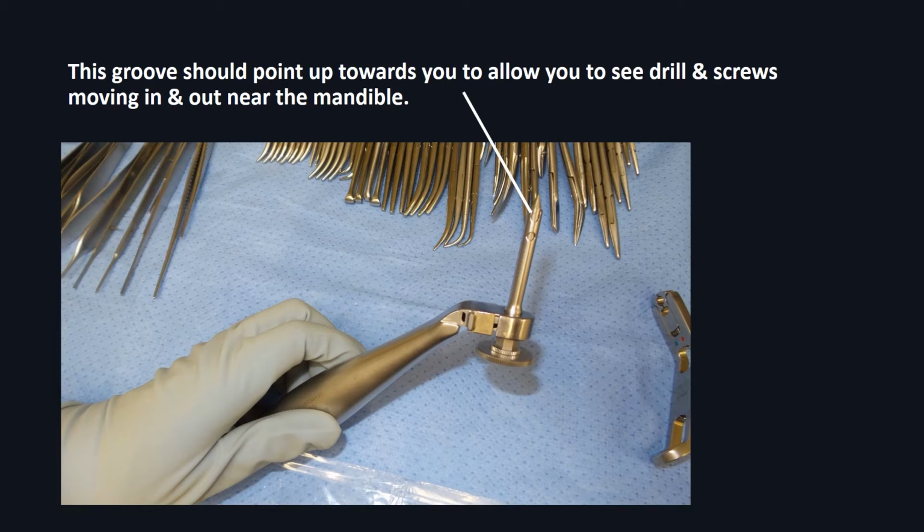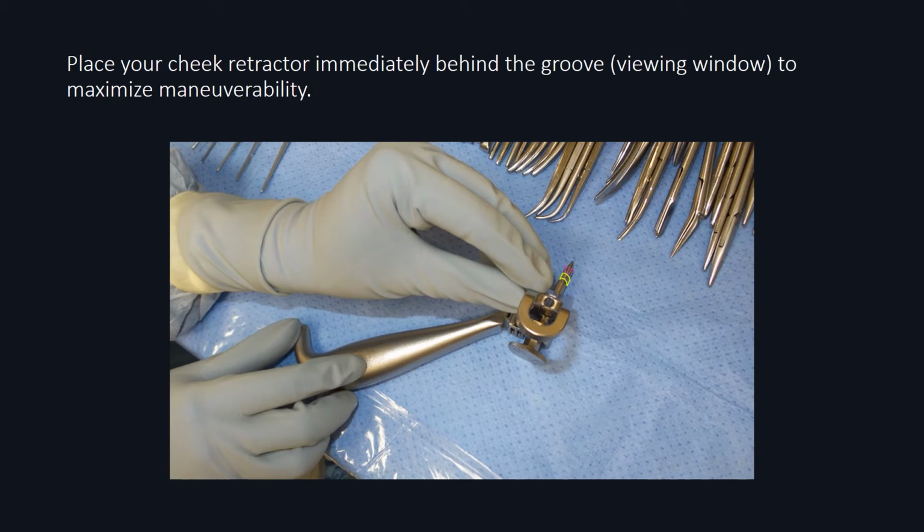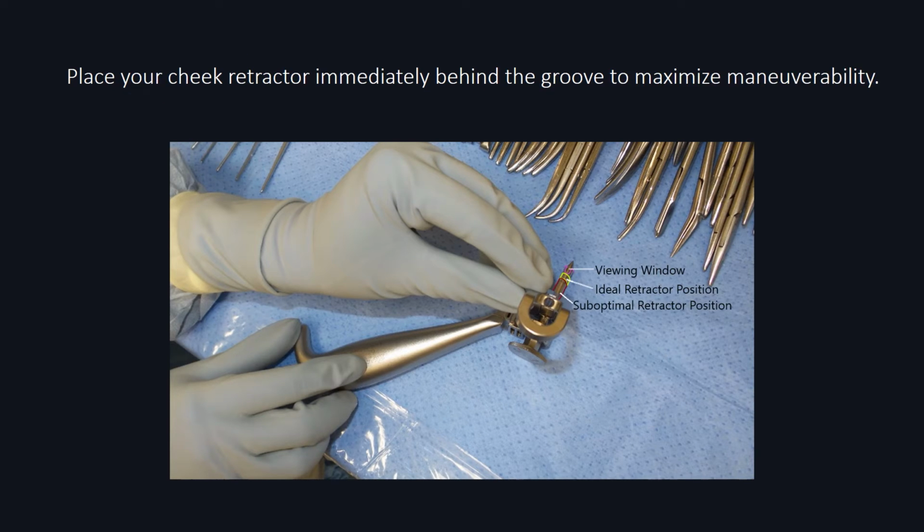When you look at the transbuccal trocar, you can see this groove. The point of this groove is for you to see the drill and screw during hardware placement. So this groove should be pointing up towards you so that it can be seen through the intraoral incision. Another thing to point out is that the cheek retractor should be placed immediately adjacent to the groove. The further you move away from the viewing window, the more maneuverability you lose, because you're increasing the distance from the tip of the instrument to the cheek retractor.